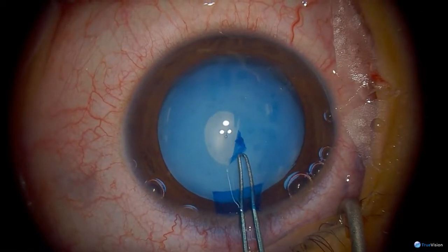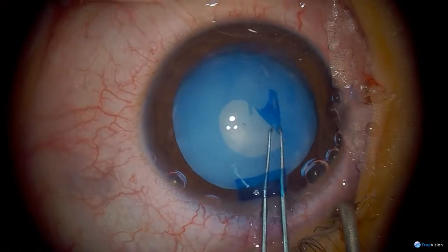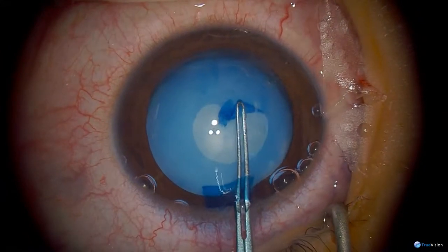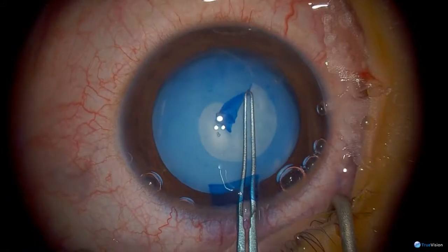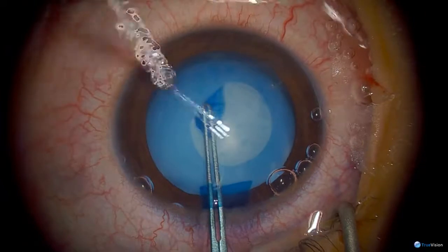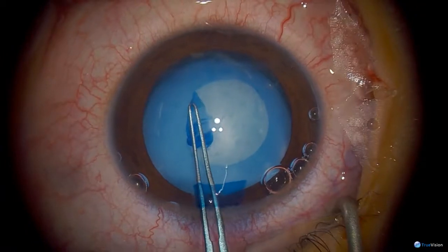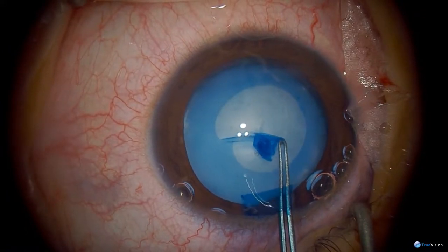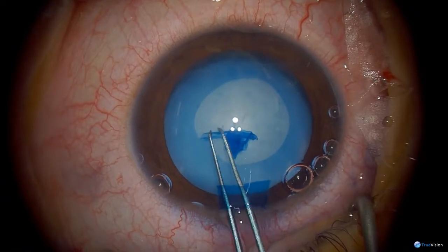This is a young man with a mature cataract. We don't know why — he's not atopic as far as we know and has never had steroids. You have to be careful not to go too wide with the capsular rhexis, so I tend to spiral it outwards slowly. Every now and then you have to pull it backwards just to get the trajectory right. It's a quite dense white cataract, and with pediatric cataracts the capsule is much more elastic than usual. The vision blue helps to stiffen it up a little bit.